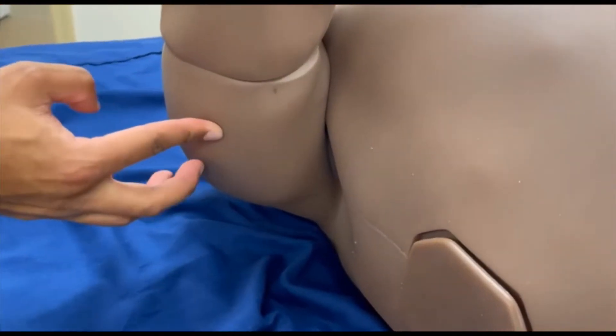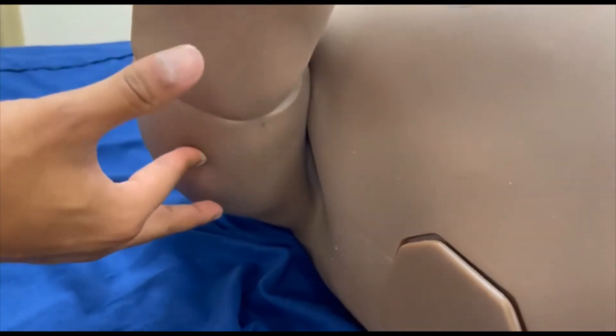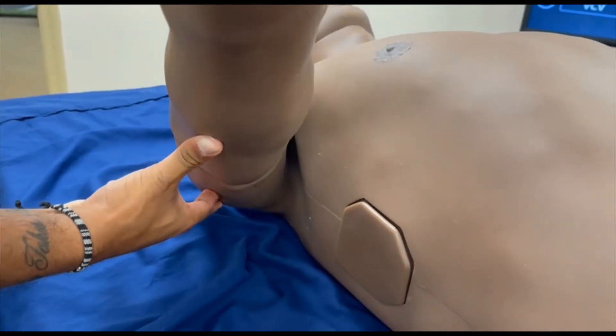For detachment, you will feel in the upper arm for a protrusion. It's a button, so press it and gently slide the arm out.